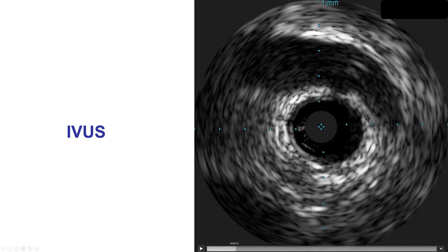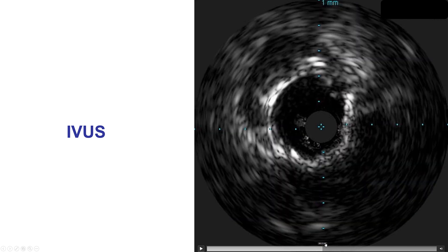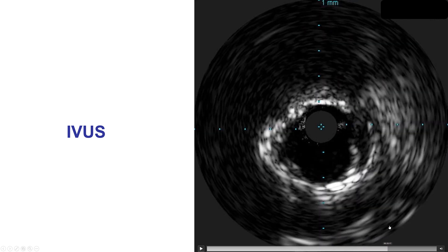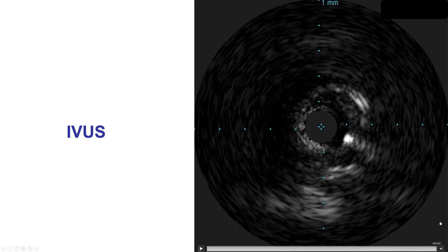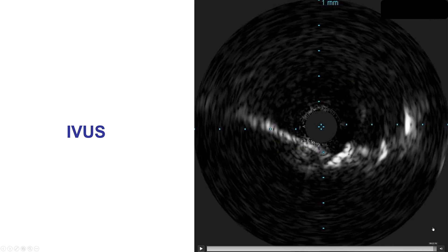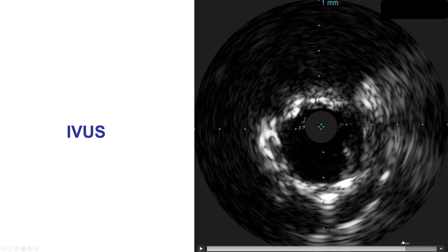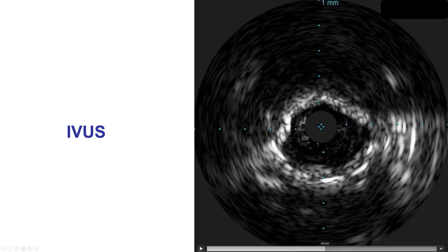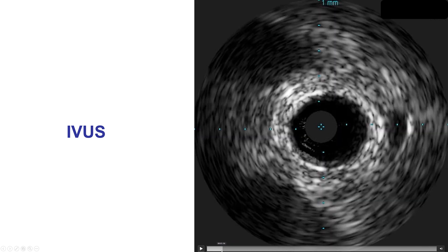We did intravascular ultrasound to better understand the anatomy. Coming back, there is an old stent, and then there is heavy calcification, coming back all the way to the left main. So we have a heavily calcified vessel that is hard to expand with previously placed stents.